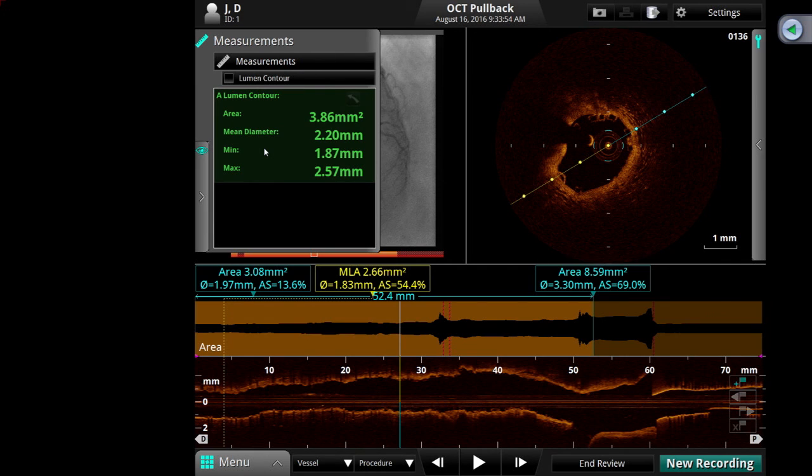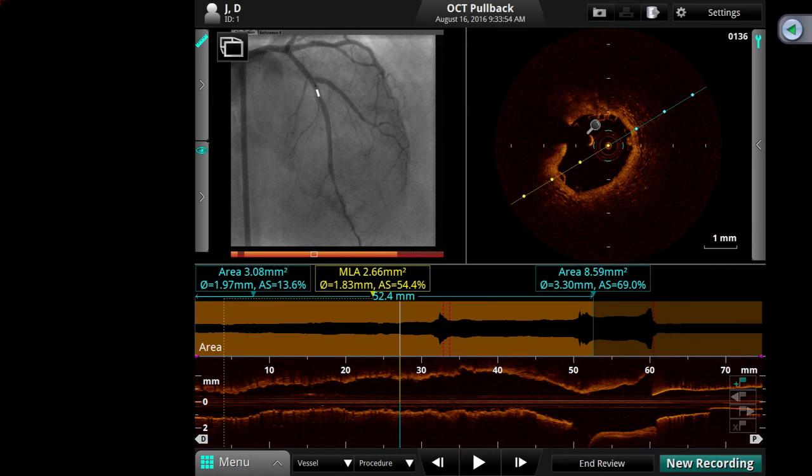But if you see where it is well opposed and not opposed, it's still less than a scaffold. You can see the size. Less than half a scaffold width. That's it, right here. Now where do we move it again? Come back here, right there. But the rest of the area is nicely opposed. Only this part. Perfect. You don't see a lot of calcium.